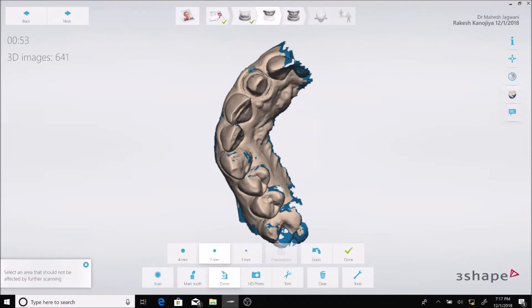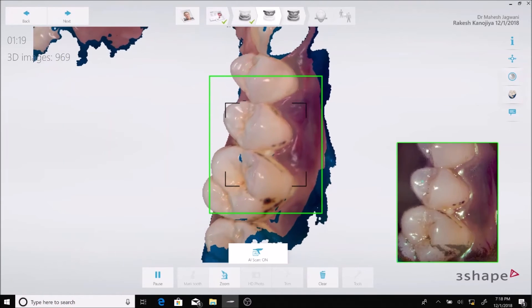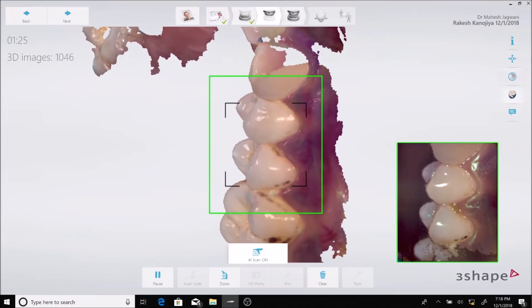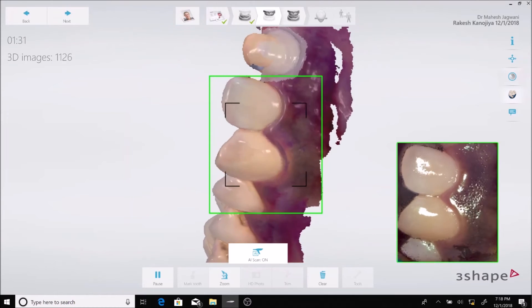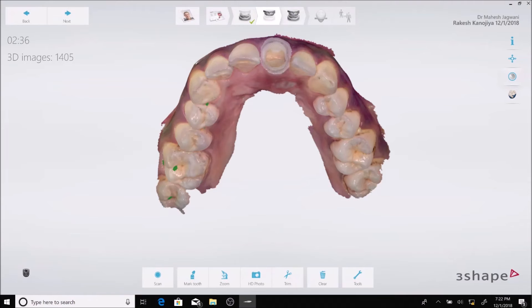The 3Shape software also has a wonderful tool called the lock tool. Using this I can lock the scanned margin because I know that the retracted gingiva will rebound, so I don't want the collapsed gingiva to be updated in my scan when I'm scanning the other quadrant. With my upper scan ready, I can go ahead and scan the patient's occlusion.